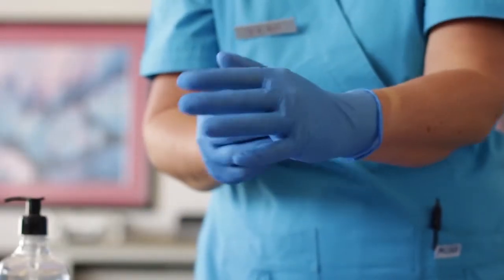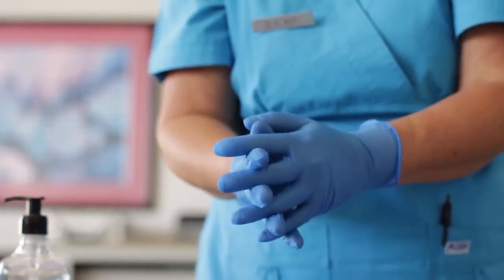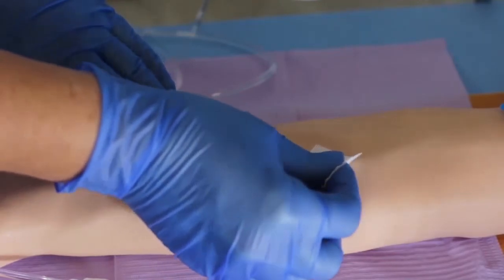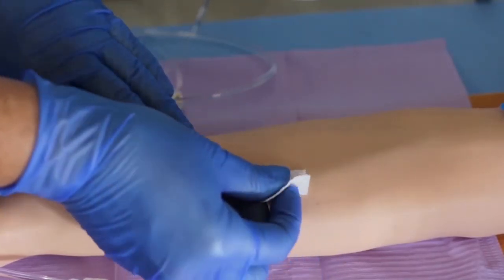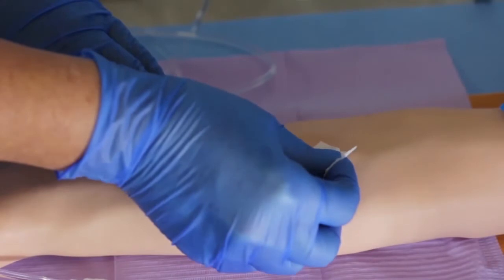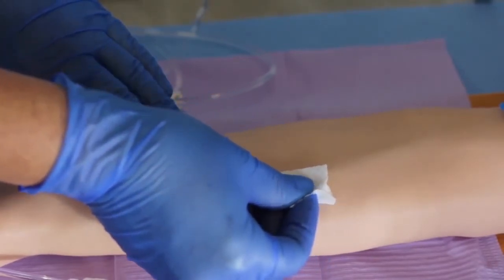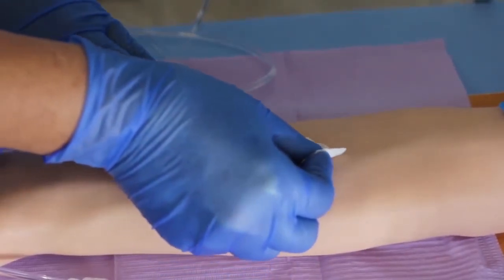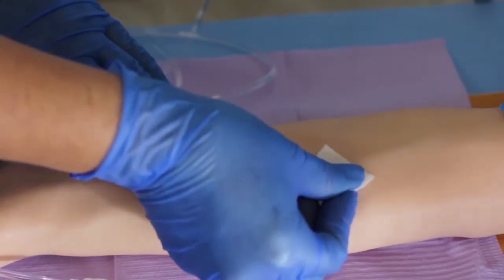Don clean, non-sterile gloves. Disinfect the site using an alcohol prep swab for 30 seconds and allow to dry completely for another 30 seconds. Do not touch the site once the alcohol has been applied.